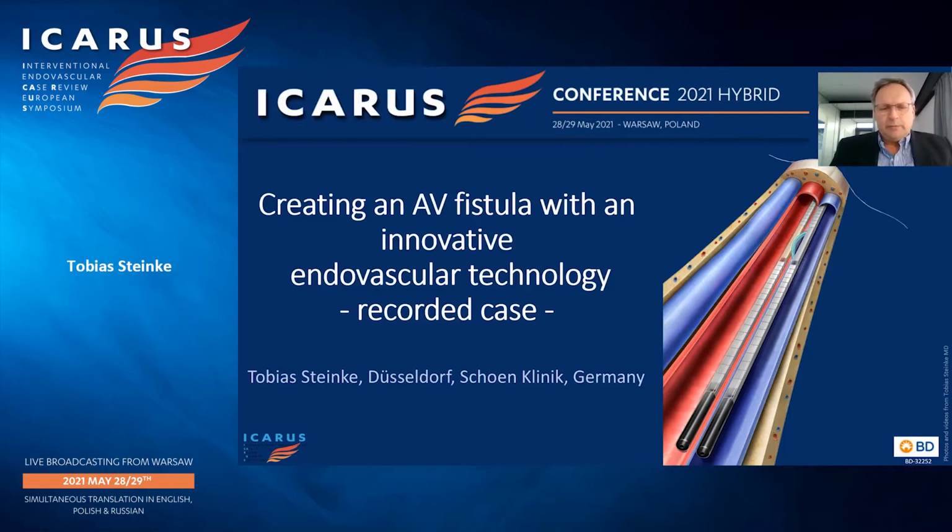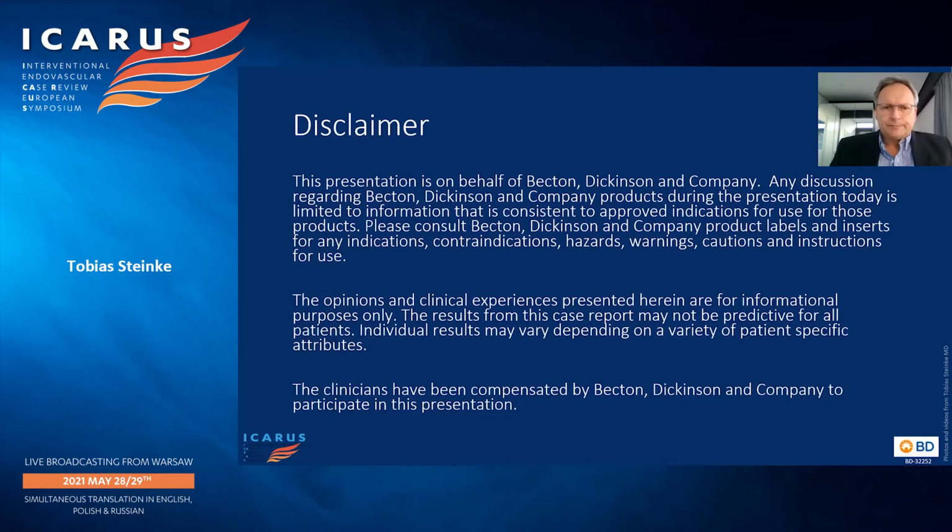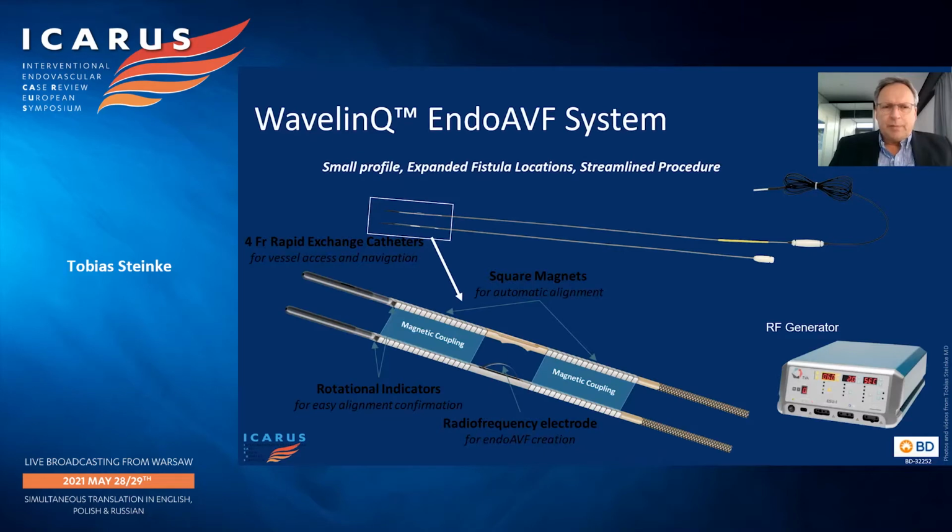And I would like to show you a recorded case of an innovative endovascular technology creating AV fistula. This is my disclosure. So we're talking about the WavelinQ endo-AVF system, and this is the French version.